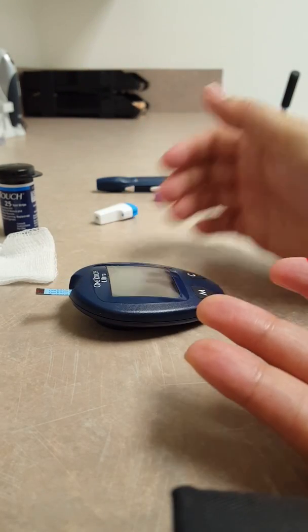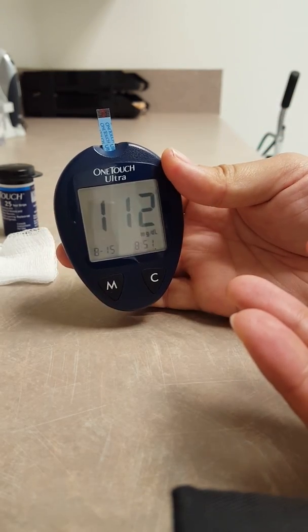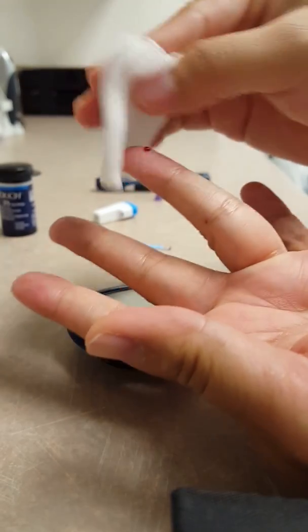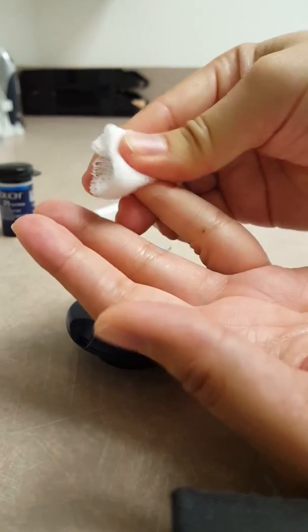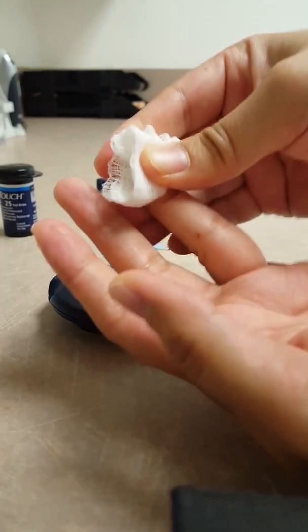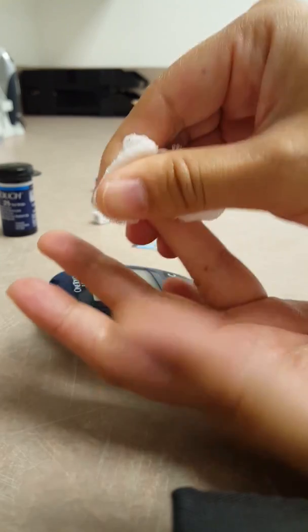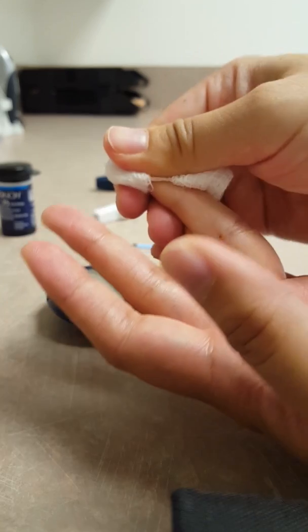I like to set mine down flat. Then you have your results — 112. According to your scale, you want to use that gauze to just hold pressure, maybe for a minute or so. Your blood sugar should be within a certain range of numbers according to what your doctor recommends, and then you will record the number and inject insulin if you're on insulin according to your sliding scale.